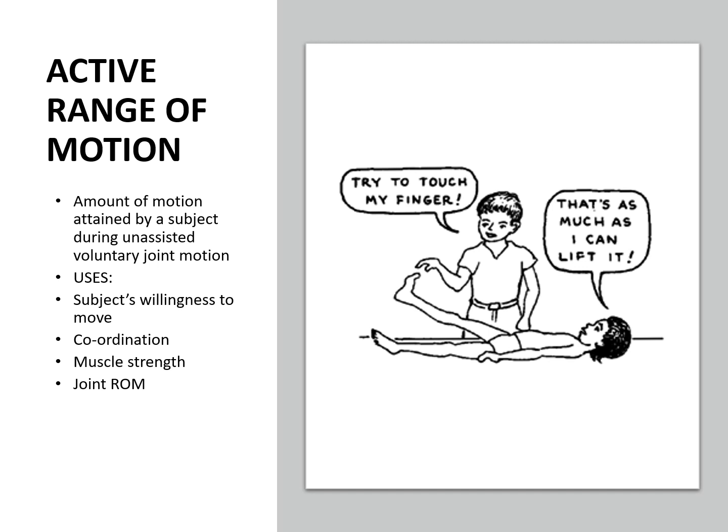In this figure the patient is trying to do hip flexion in supine position without any external support. When you do that, that is known as active motion. And when you measure this motion with the help of a goniometer and document it in degrees, that is known as active range of motion. Okay, I hope this is clear.